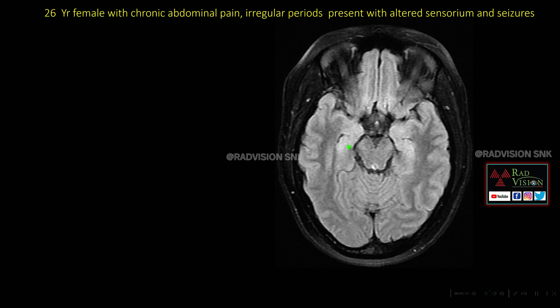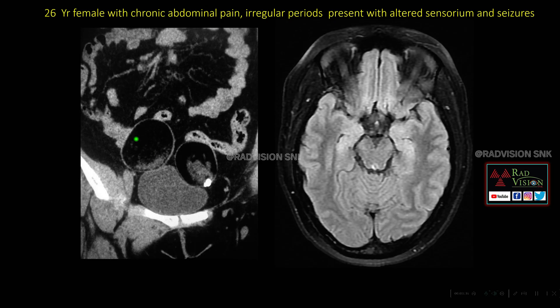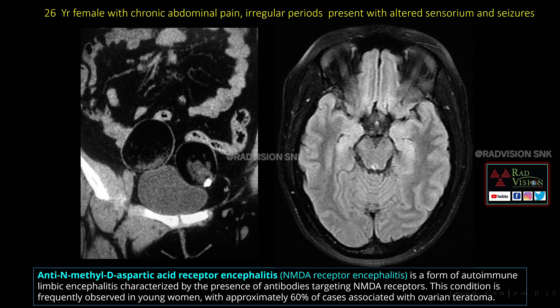Next — 26-year female with chronic abdominal pain, irregular periods, presented with altered sensorium and seizures. Here you can see there are subtle FLAIR hyperintensities noted in the bilateral medial temporal lobes along the amygdala and hippocampus. The patient also has chronic abdominal pain, so we screened the abdomen — here you can see classical bilateral ovarian dermoids.